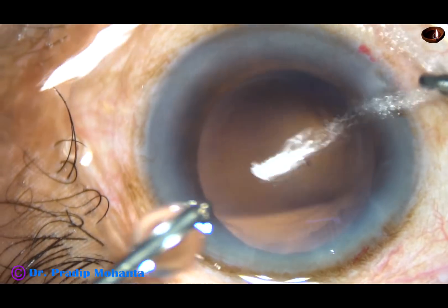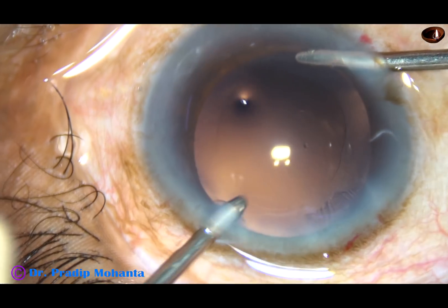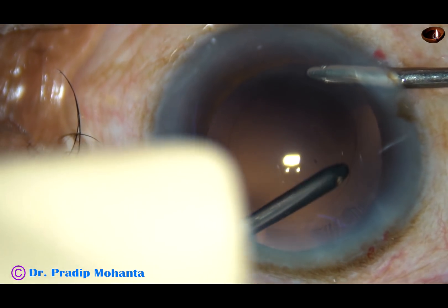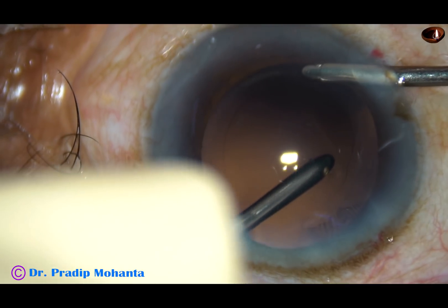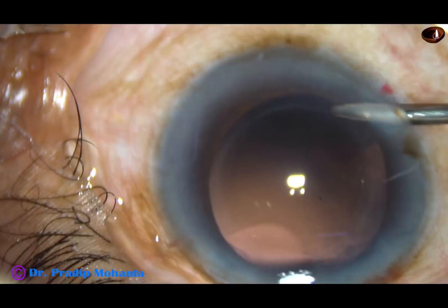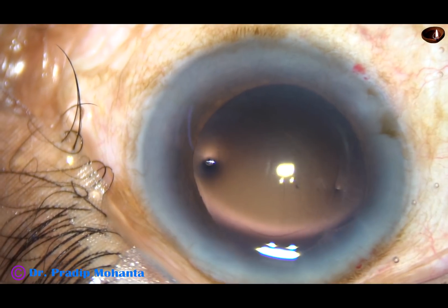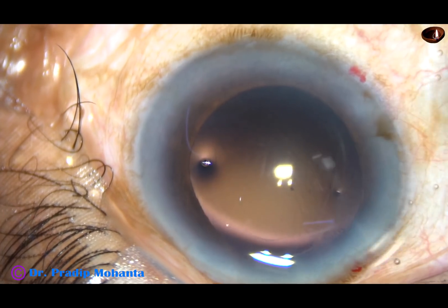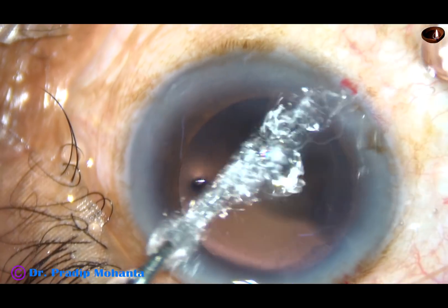Now this is capsular polishing by IA2 mode. Here the vacuum is only 20 mmHg and flow rate is 15 ml per minute.